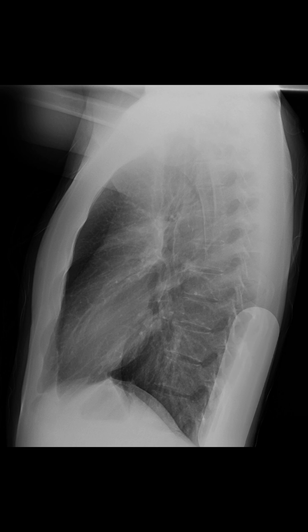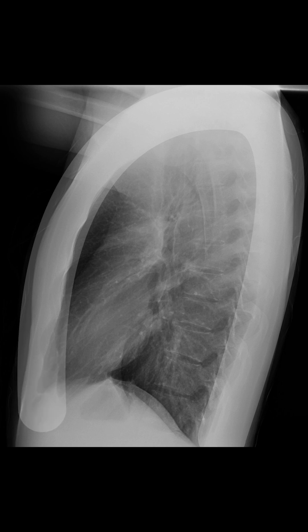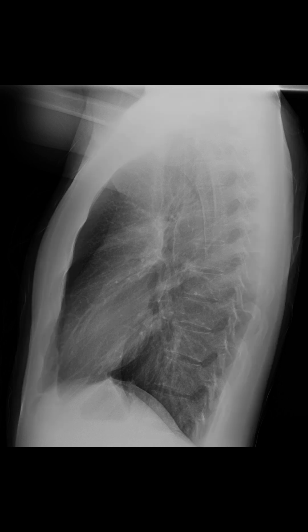You're going through the thoracic vertebrae, looking for any kind of fractures. You're looking through the soft tissue up top and down the front in the sternum. The lateral view is probably a great place to look for vertebral compression fractures too — the lateral view is looking at the spine a little bit more.